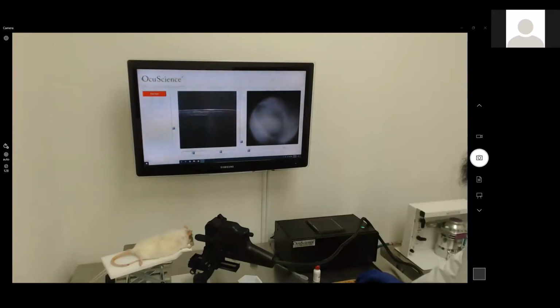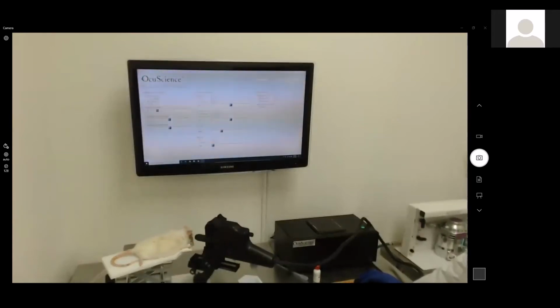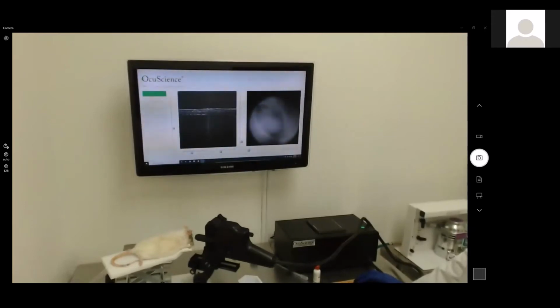It really is the OCT in any system, there are people who are going to work the anterior segment and those who are wanting to do things in the posterior segment. What we're trying to establish with our OCT is that you can pretty much with one system move from front of eye to back of eye. So we're able to capture a bunch of this data.